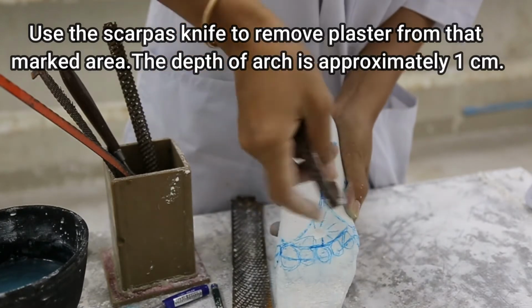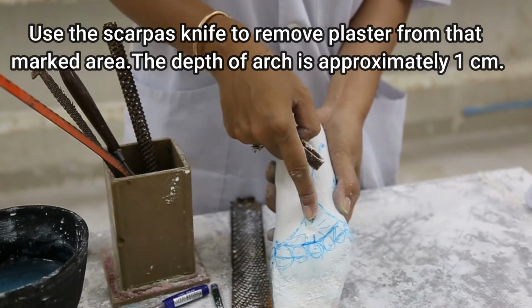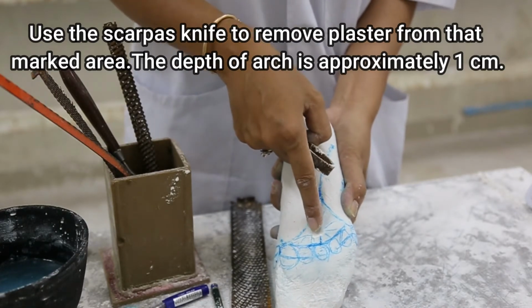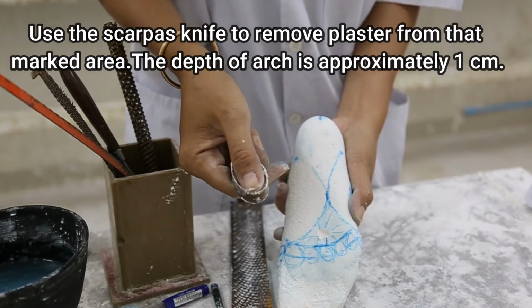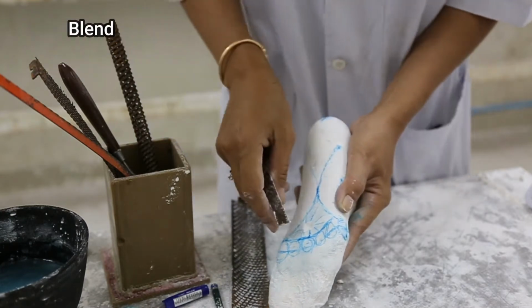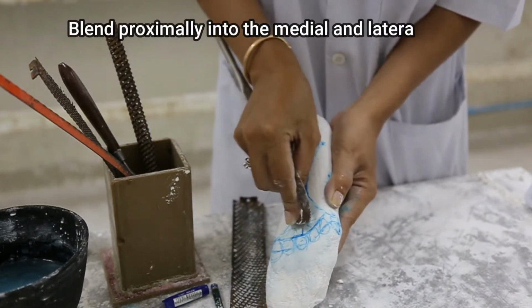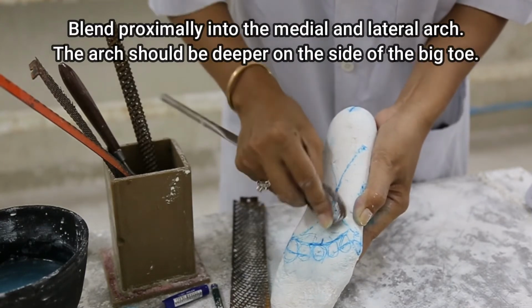So for the depth, as I said, it can be from 0.5 centimeter to 1 centimeter. But we need to see how the patient's leg is and how the patient can tolerate the transverse arch or dome. Okay. So after we reduce it, you just blend it around.